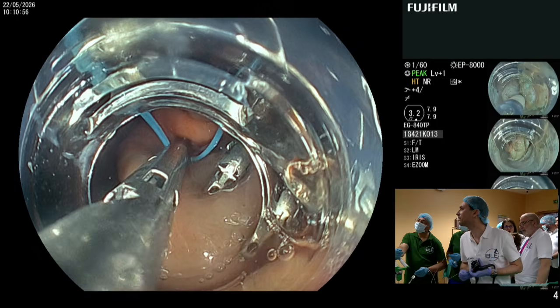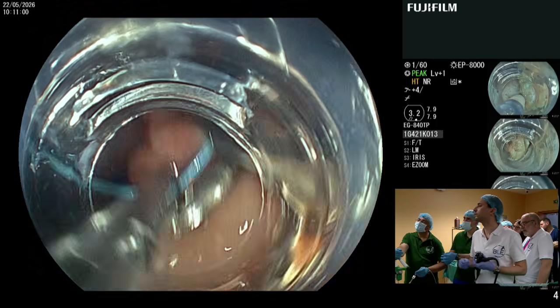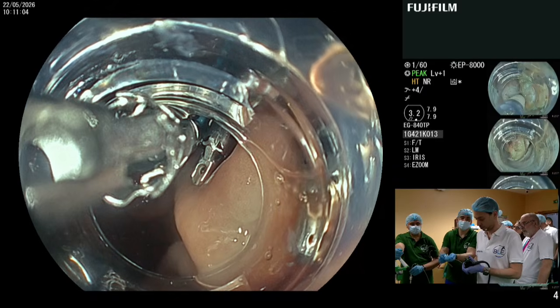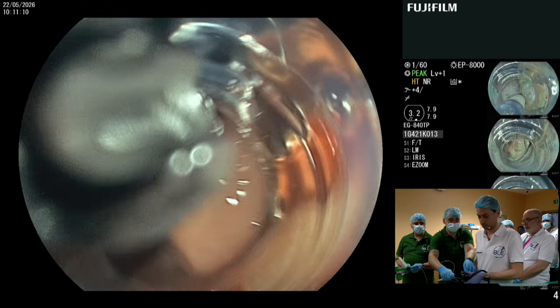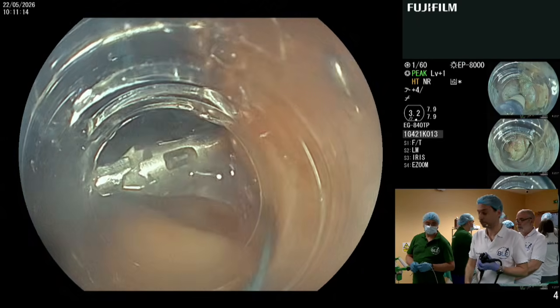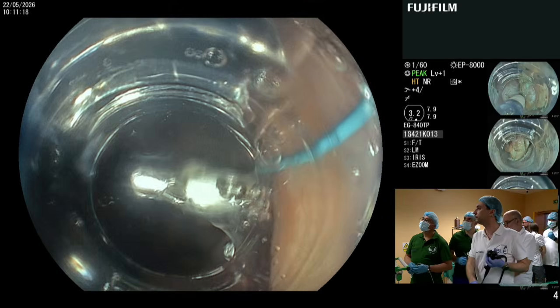Open. Close. Fire. Okay. Now we have. Oops. Have to close a little bit the loop, but yes, pull back. Okay. So close. Yes, like this, a little bit.